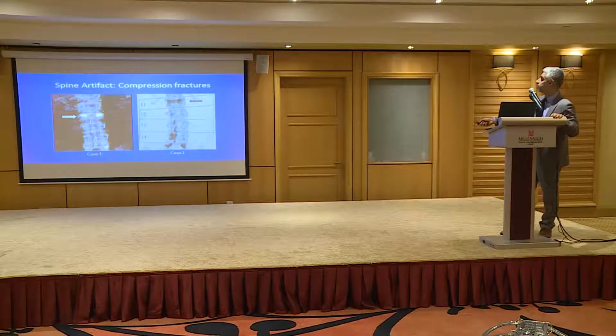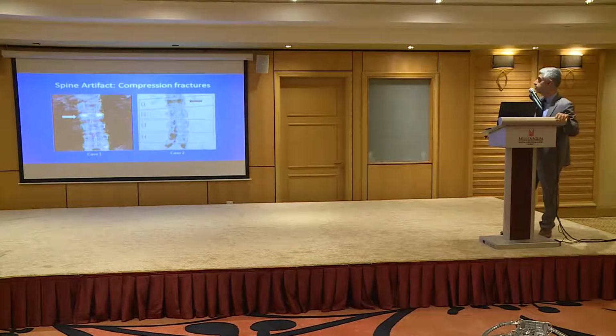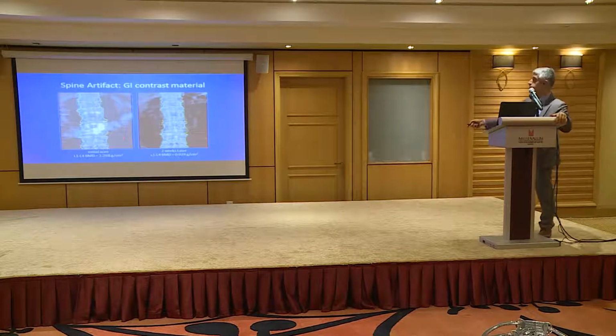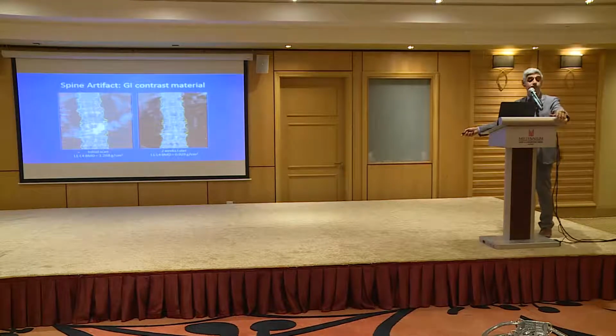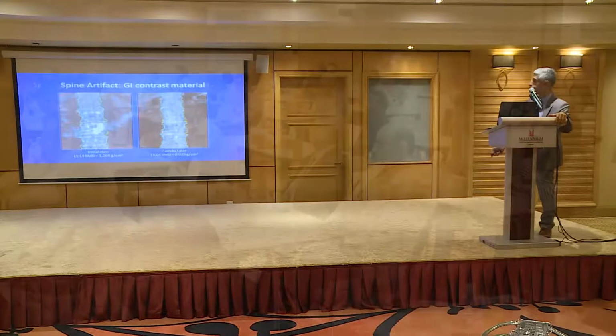Okay? And this is also a fracture, maybe not much loss of height, but this could also be another compression fracture. This is GI contrast. You can see the column filled with contrast, so it's actually increasing the density of L3 here. So it's not the right time to do a DEXA scan on this patient. This is after 2 weeks, all clear.